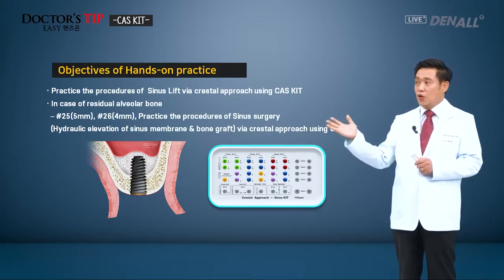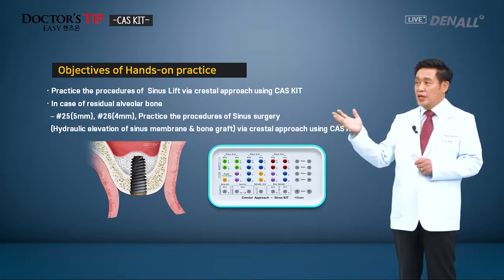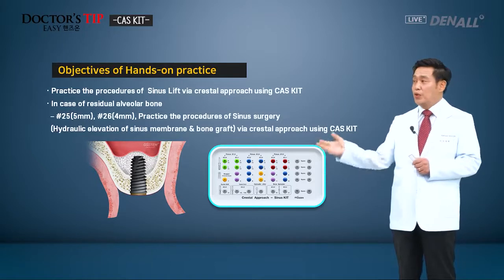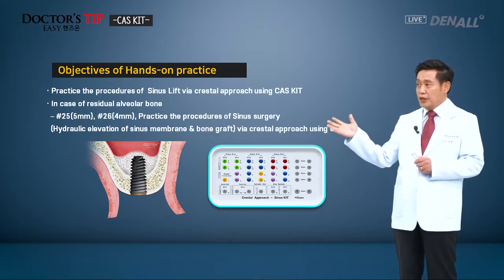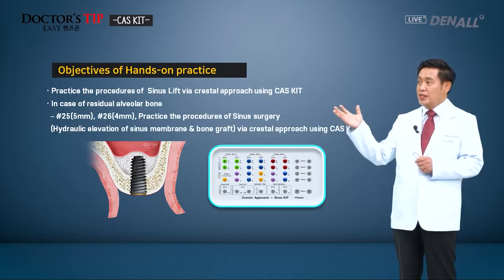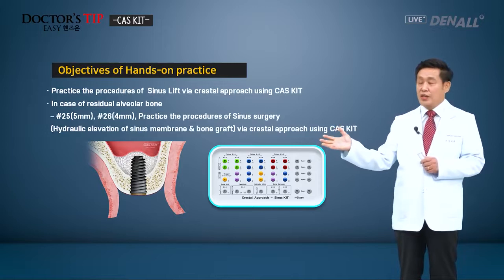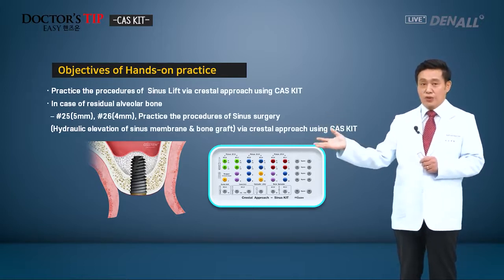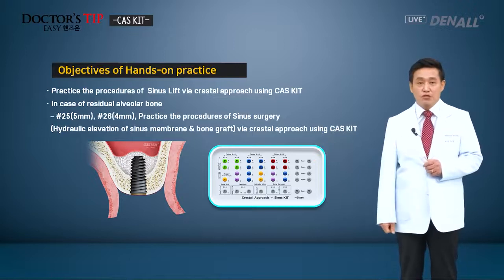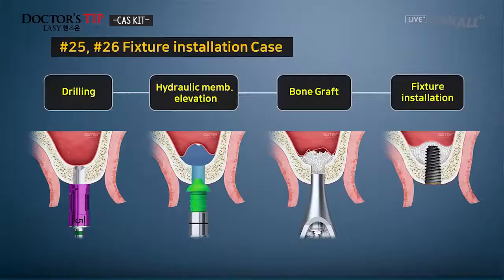Through the crestal approach, sinus lift will be made. Bone materials will be inserted to place an implant. Using the CAS KIT, the sinus floor will be penetrated. The main function of the CAS KIT, the hydraulic membrane elevation, will be done safely, followed by bone grafting and implant placement in this hands-on.